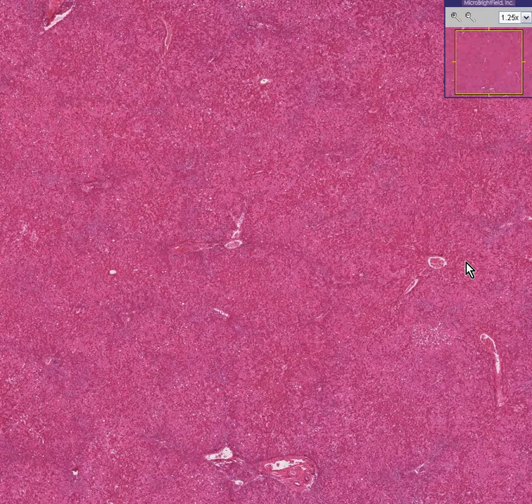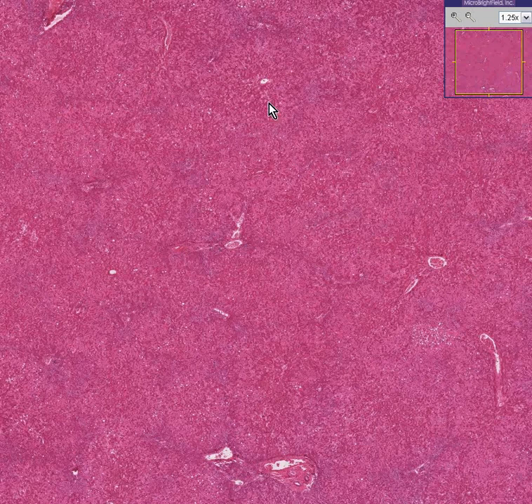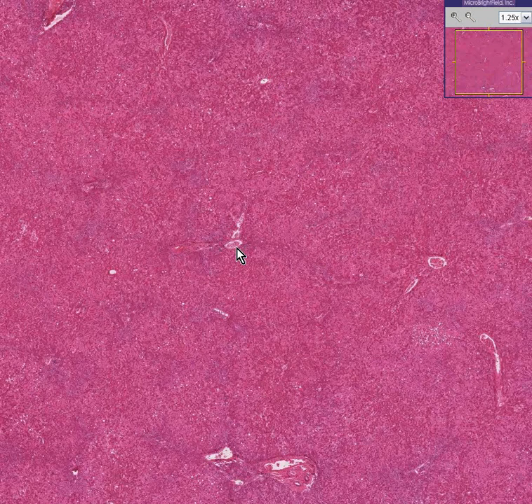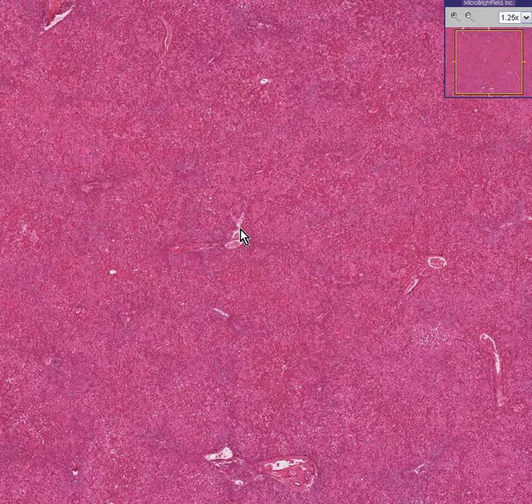And if you could see general spacings between central veins and portal areas, you know you're not dealing with cirrhosis. But it still doesn't look quite right, does it?